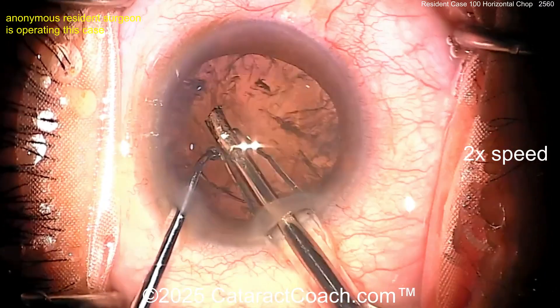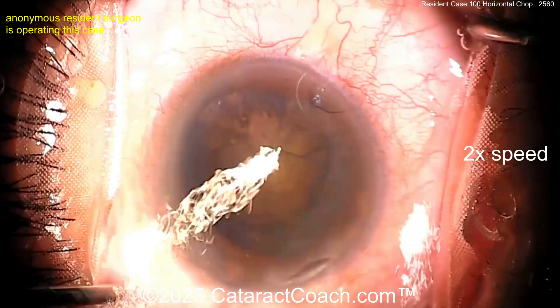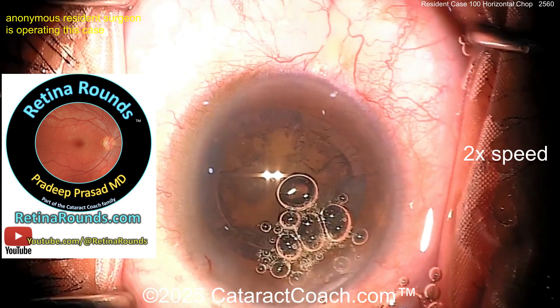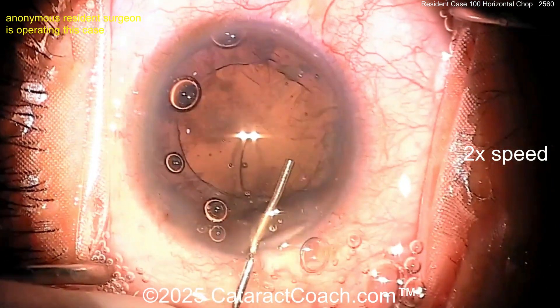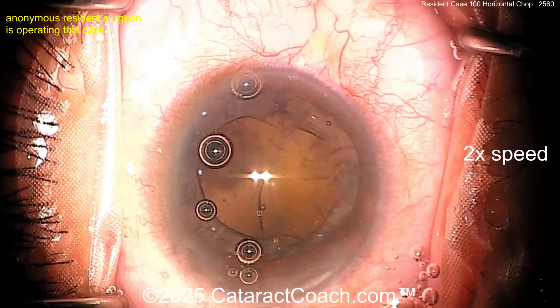Here's the last piece. I'd like to protect the bag — don't do anything risky here, you've got a nice case at case 100. Don't try to get out that cortex with that probe. I'll tell you about Retina Rounds — that's our sister channel. If you're a young resident, you have to learn important retina material that even a general ophthalmologist will need to know.